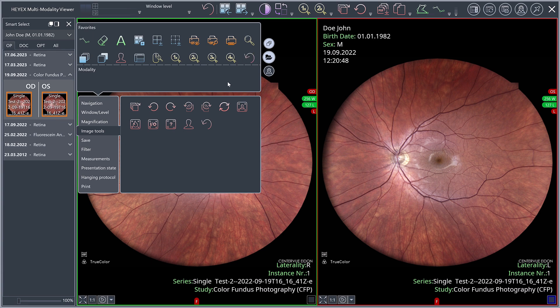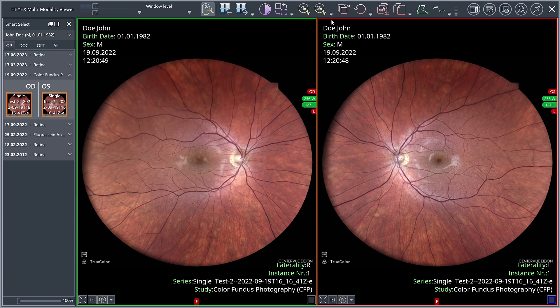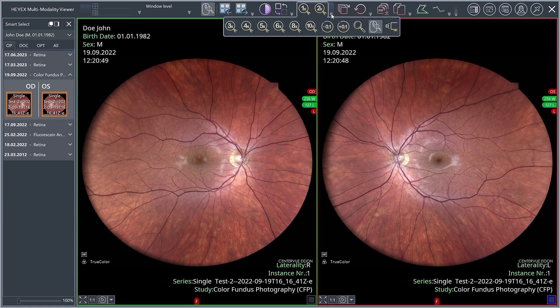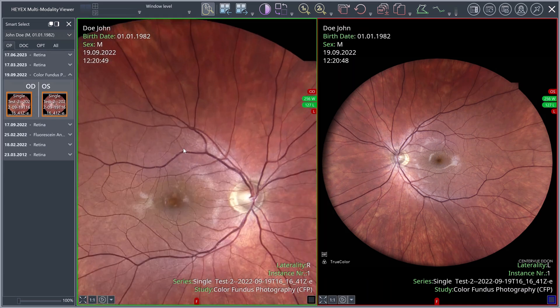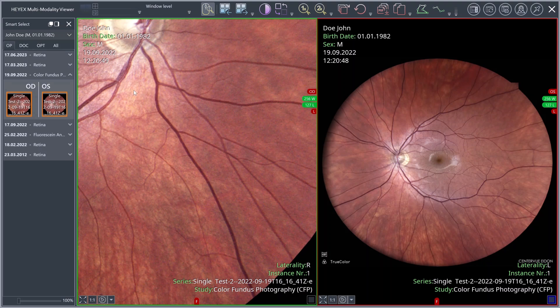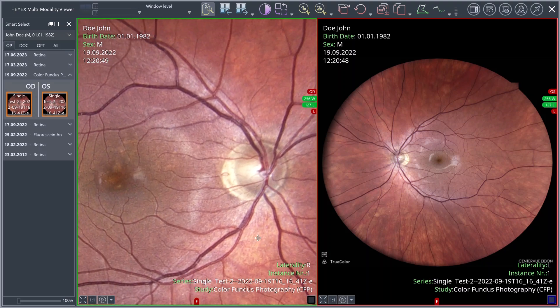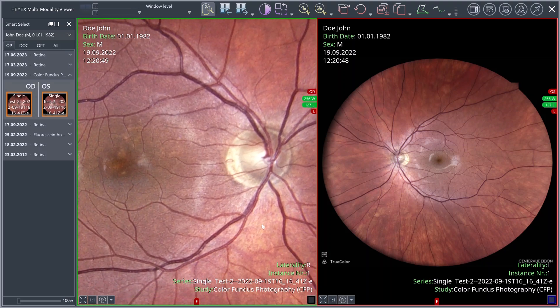The zoom function, for example, is a useful tool. In addition to fixed magnifications, you can also use the mouse wheel to intuitively enlarge the desired image area. Activate the zoom tool with the mouse wheel via the ribbon bar or the context menu. Now you can zoom the images by rolling and move them by clicking and holding the right mouse button. To deactivate the zoom mode, click the zoom button with the mouse wheel again.